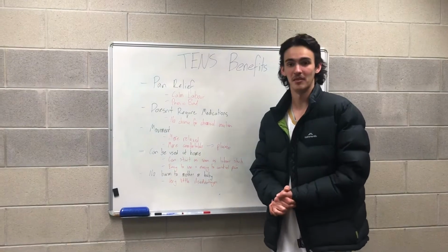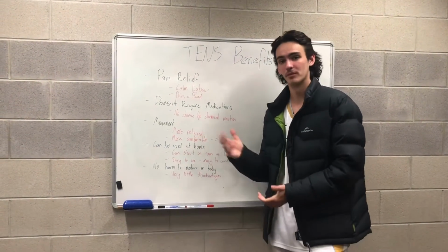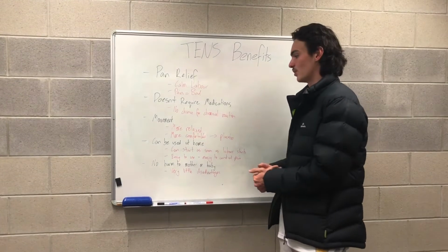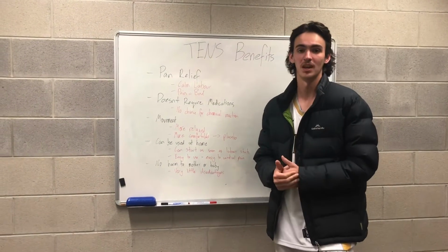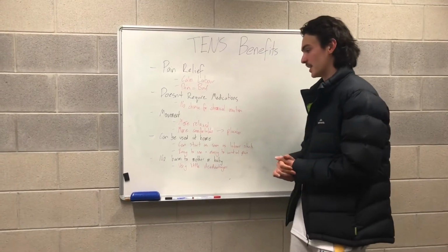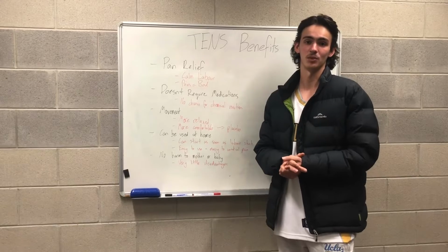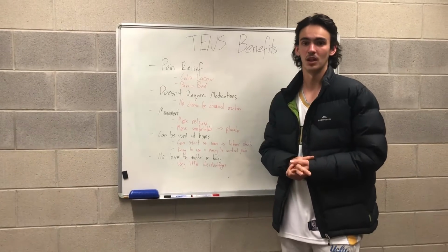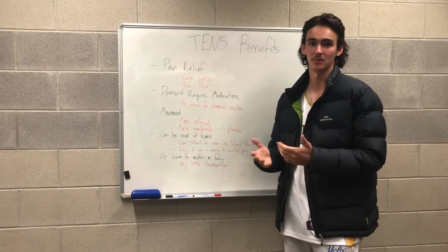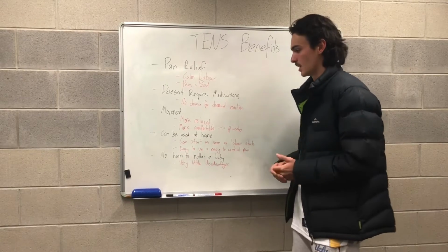Continuing on to another benefit of the TENS machines, we have movement. Patients such as Gertrude will often feel a lot more relaxed and a lot more comfortable if they are able to move around relatively freely. In addition to this, it also creates a little bit of a placebo effect as they'll feel more confident that their labour will be successful as they'll be experiencing less pain by using the TENS machine.